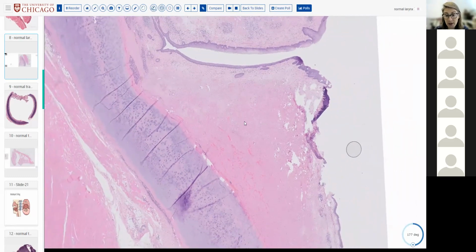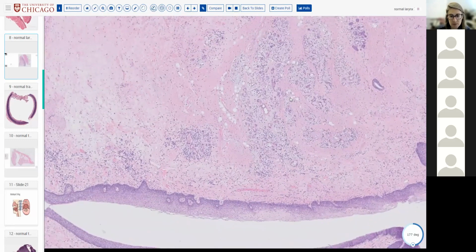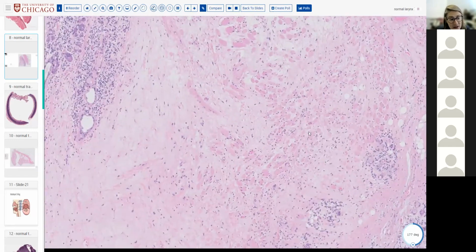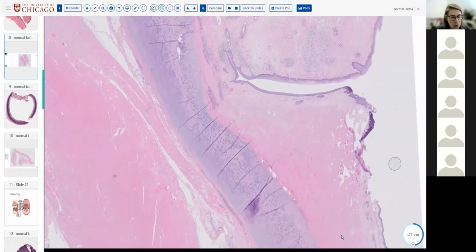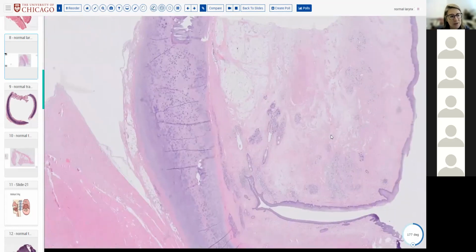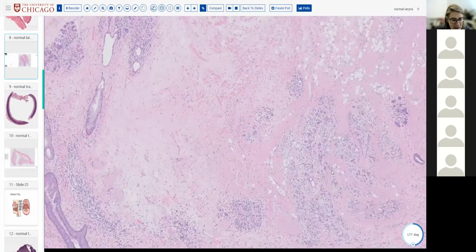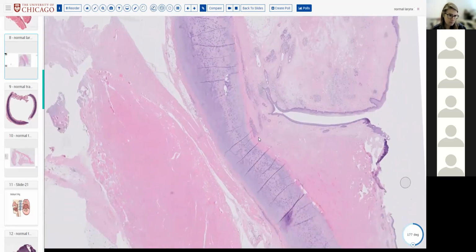So that's how we know where we are anatomically. Microscopically, it's the presence or absence of skeletal muscle, and then the presence or absence of these mucosal glands. There's a little bit of skeletal muscle in the false cord as well, but the vast majority of this true cord is occupied by skeletal muscle in a triangular shape. So thyroarytenoid and vocalis, only a tiny touch of skeletal muscle in the false, mostly just these glands. All right, so that's how we know the microanatomy of the larynx and where we are.